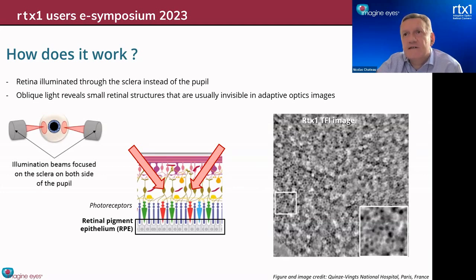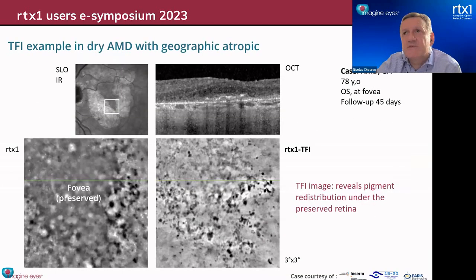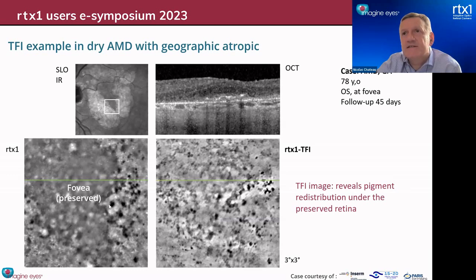Now, this is a new modality, and as such, it's an exploratory modality. I want to show you an image that I got from Kyoko and Michel's group in Paris. It's an example of the use of TFI in dry AMD. So here you see the conventional infrared SLO image of this case with atrophy and a central sparing. And here the OCT also showing the spared foveal area. This is the standard rtx1 image. Of course the magnification is higher, but here we can see the delimitation between the spared area and the atrophic area. And we can see some preserved photoreceptors in the sparing.